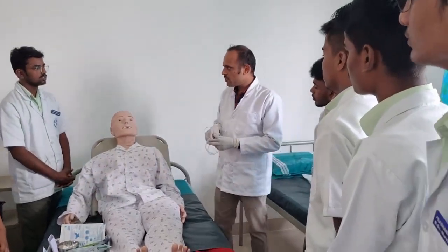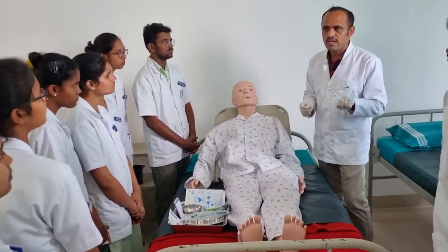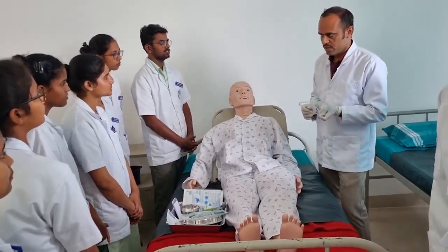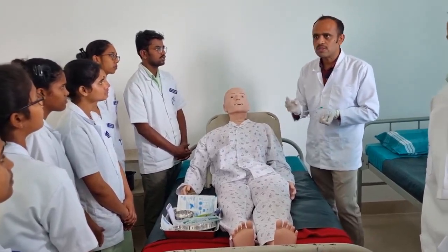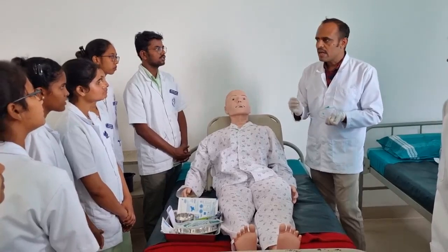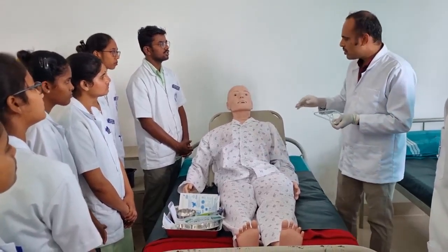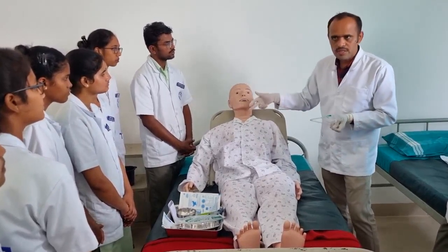The measurement of that NG tube we call in French, that is 1 centimeter is equal to 30 French. While inserting, how will you come to know what length of the tube has to be inside the stomach?